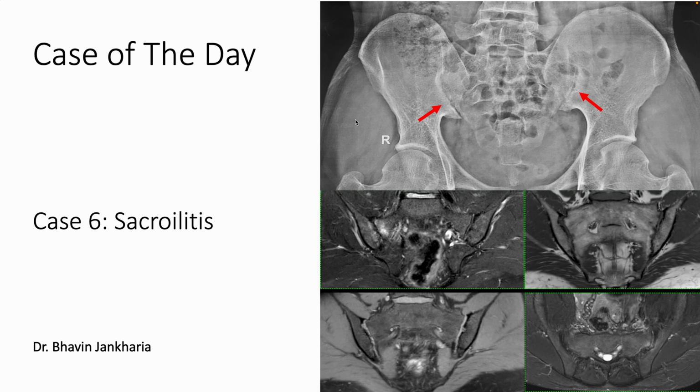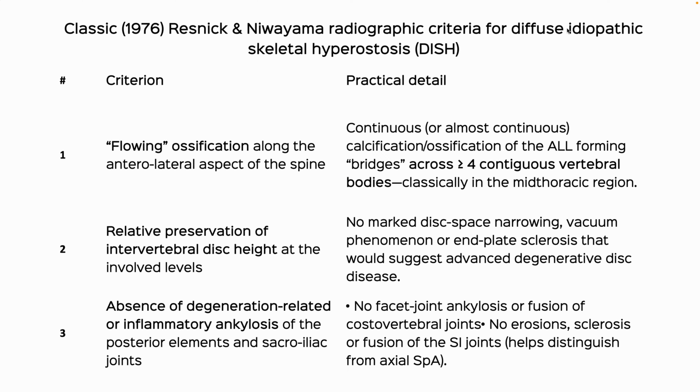I did case 6 and I discussed sacroiliitis and axial spondyloarthropathy and the protocol, and you'll find the link to that in the top right of this video, and I will also give the link at the end.